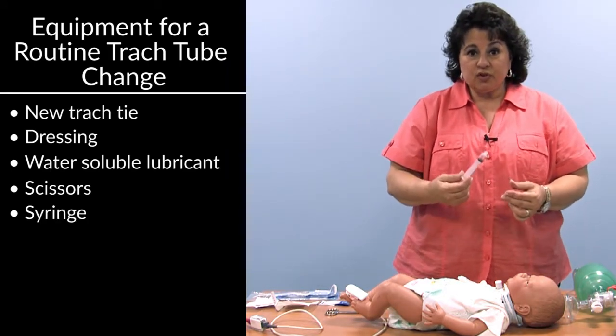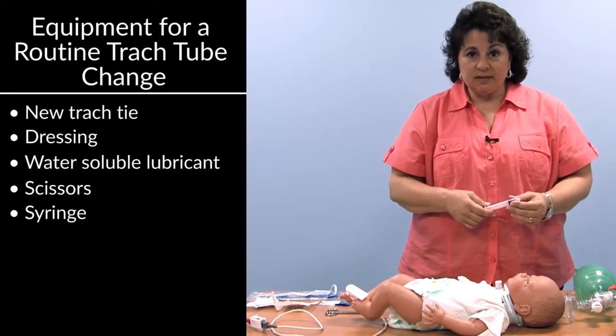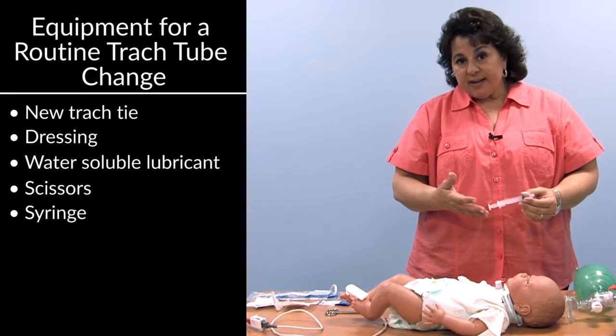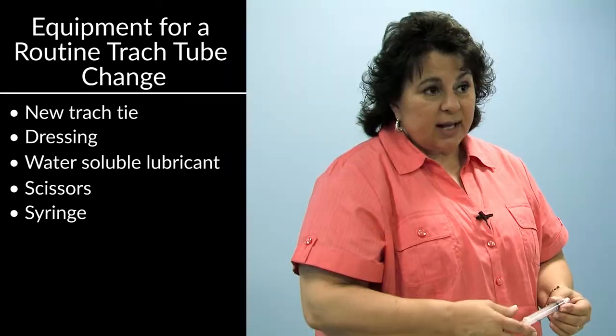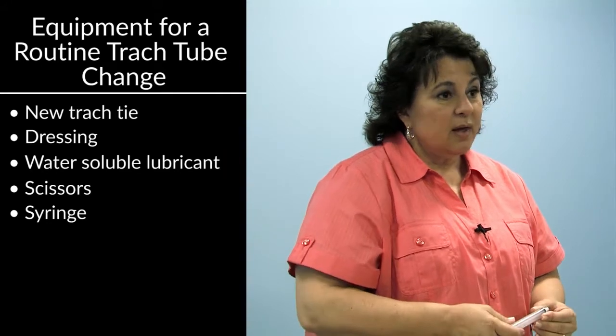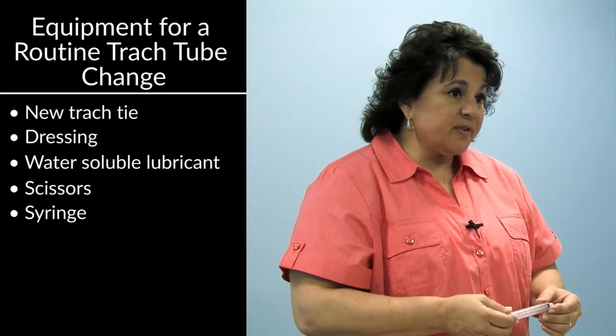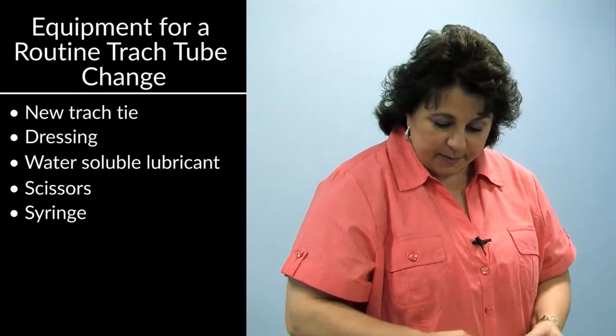You'll also need the syringe to test the tube that you're going to check before you insert it into the child. Some brands of tracheostomy tubes, such as Shiley, use air to inflate the tube cuff. Other brands, such as Bivona, use sterile water to inflate the tube.